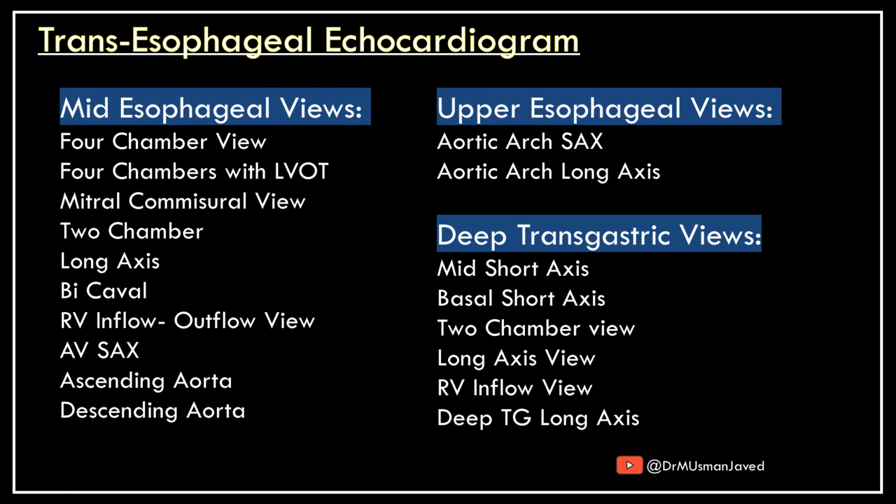Here is the summary of all the major views we covered. We can get more views by little manipulations according to the pathology found.